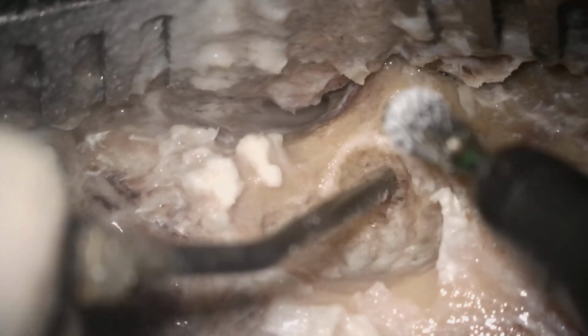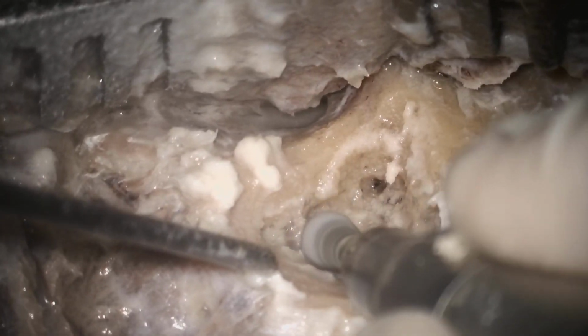If you have entered into the cortical mastoid without identifying the lateral landmark, you can damage at that time. So if the damage already has been done, then what is the role of enlarging the cavity? So from the very beginning.